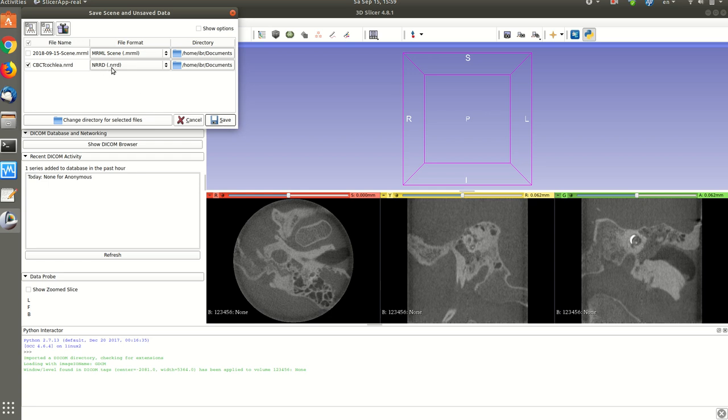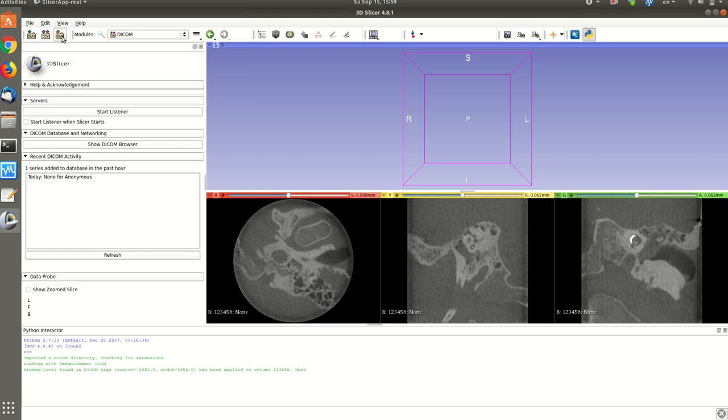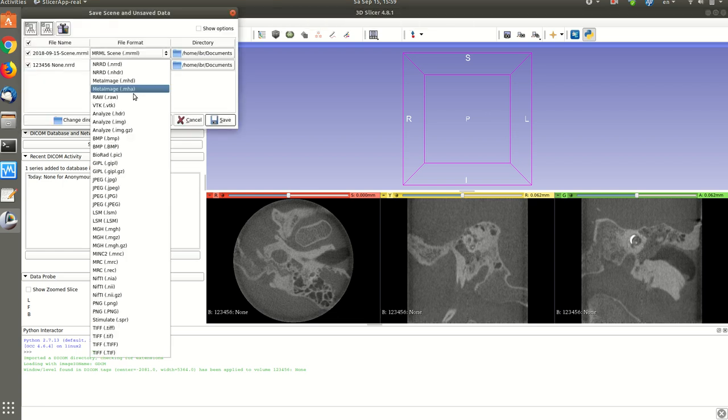Here it's already in NRRD format. I can change it to a different format. There are a lot of other formats we can save in.